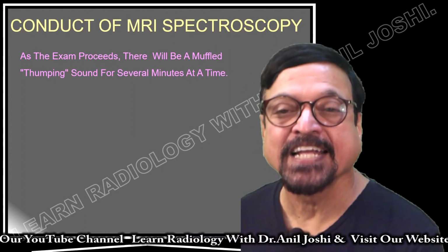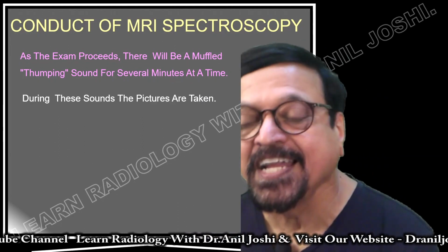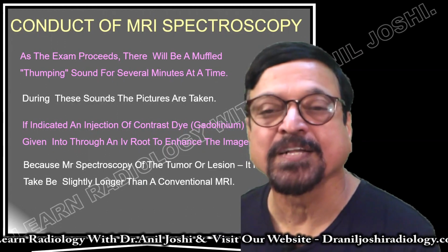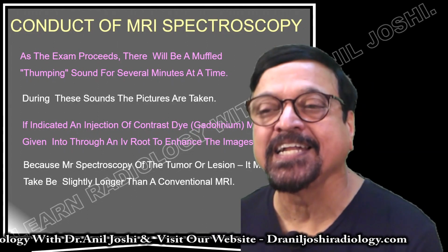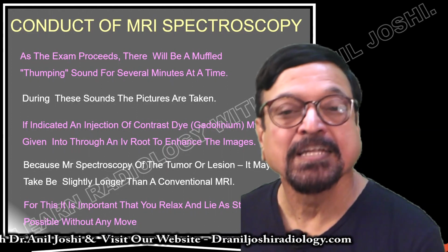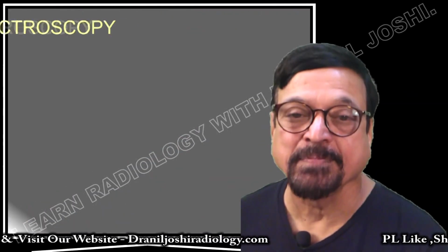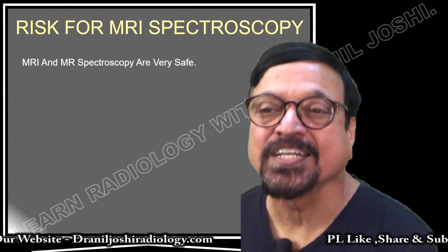Now this we have covered in a different lecture. Do visit it so that you will be mentally strong before going to the MRI suite and you will not have any trouble. Your examination will go unnoticed. Otherwise the examination, which should not take more than 10 to 15 minutes, may take half an hour or more. If you move, a sequence has to be repeated. There are multiple sequences and each sequence takes minutes. So ultimately it piles up to a delay of 15 to 20 minutes. So as far as possible the patient should cooperate. There should not be repetition. All the sequences can be taken and the MRI examination can be done faster.